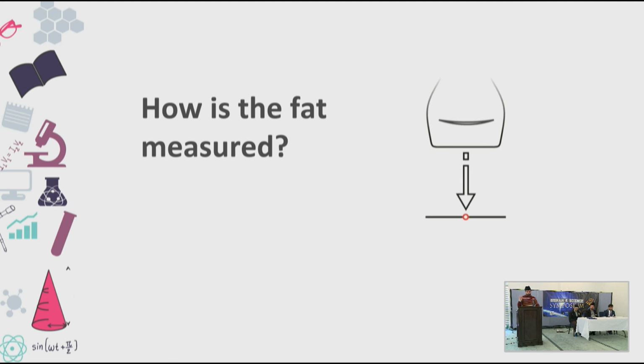So how is the fat measured? I use high-intensity focus ultrasound to push on a localized region. I record the response of that high-intensity focus ultrasound in that region. The smaller the displacement, the more stiffer the tissue is, indicating a presence of more fat.